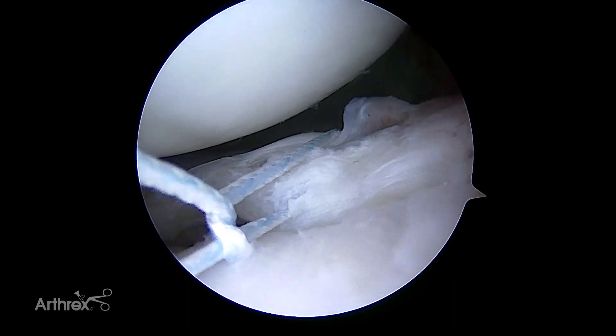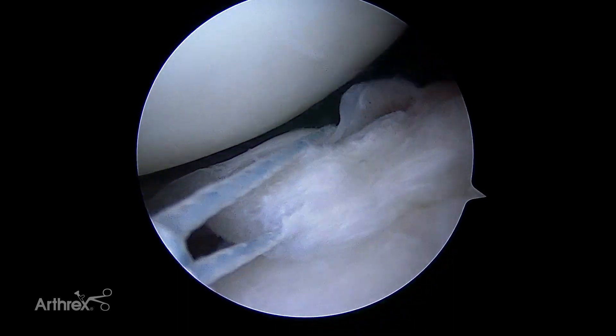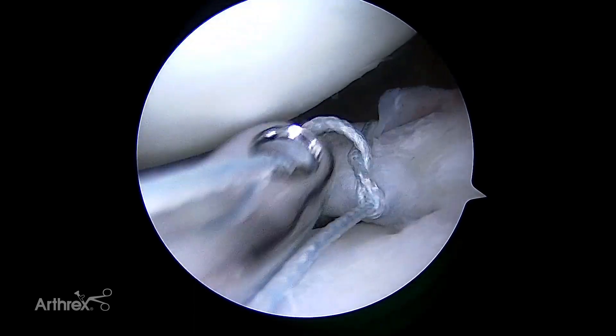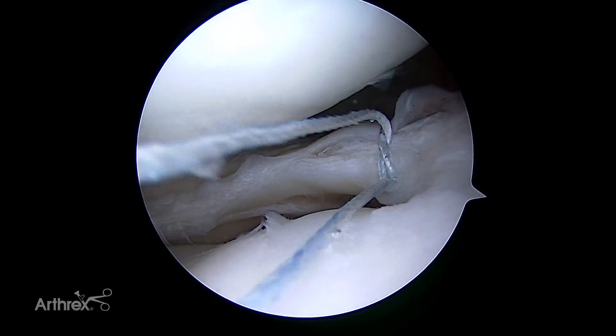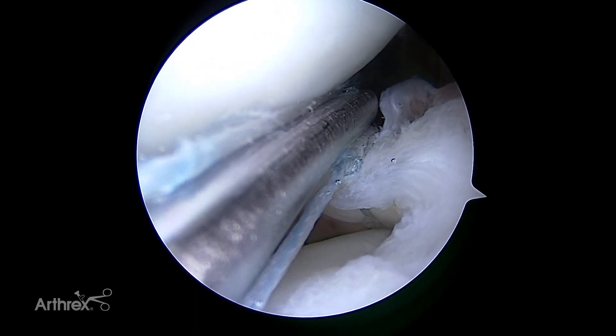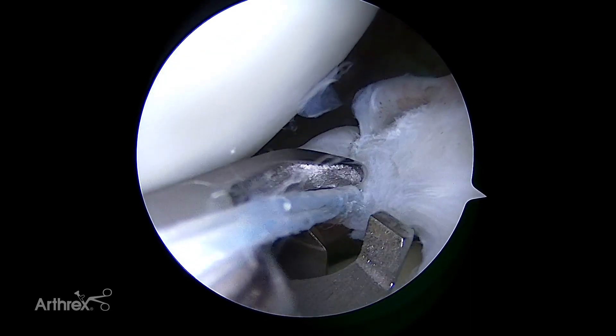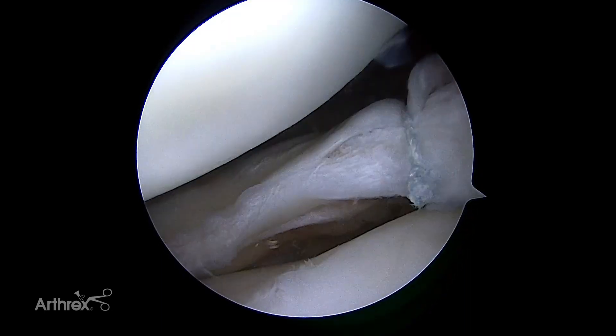An arthroscopic suture knot of the surgeon's choice can be performed with the usage of a knot pusher. My preference is for a Revo type knot. It is helpful to try to keep the suture knot toward the periphery of the meniscus if possible. After the first suture is tied, subsequent sutures may be placed. Care should be taken to avoid snaring the other completed sutures to prevent accidental cutting of them.